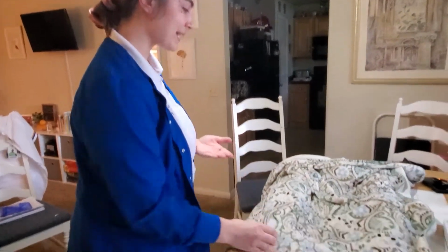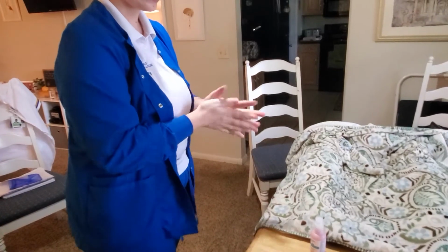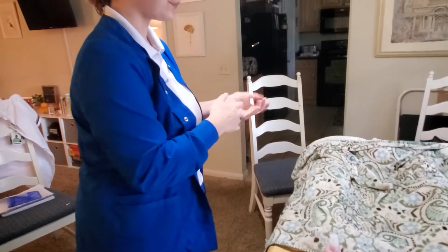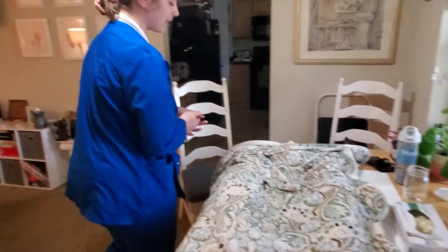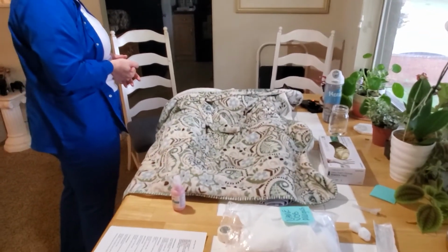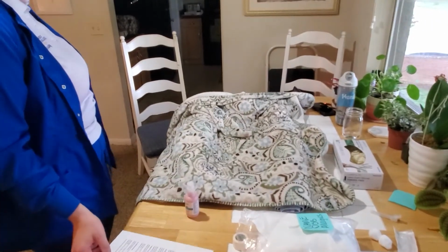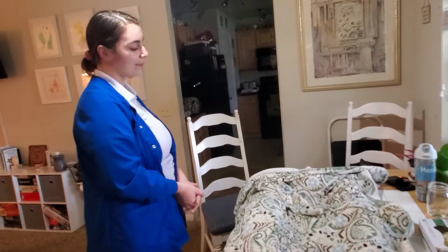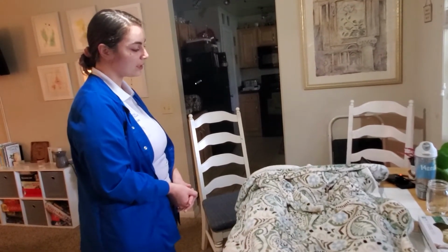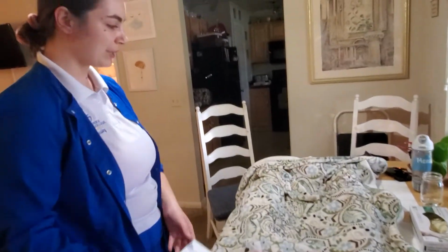Hi Anna, my name's Katherine, and I'm going to be your student nurse for today. So today I'm going to be doing a Foley catheter insertion. Could you please verify your name and date of birth for me, please? Okay, Anna Pawlowski, 5/5/57. All right, Anna, do you have any allergies that you'd like to let me know about? Penicillin? Okay. And do you know what happens when you take penicillin? Okay, so you break out in hives? Alrighty. Well, thank you for letting me know that.